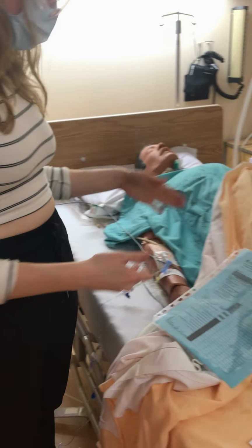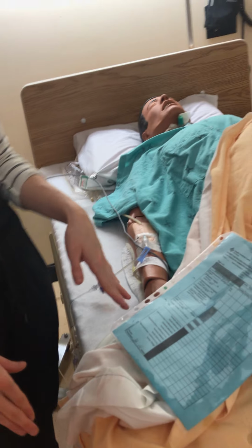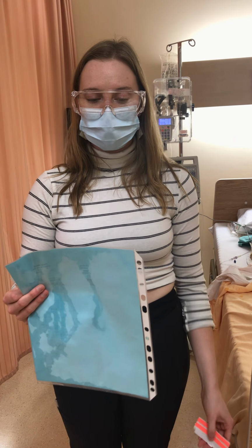I'll tell the patient to call me if they're experiencing any strange side effects or symptoms. I'd make sure to check up on their vital signs. I will sign the MAR with the date and the time as well. I'll get my second nurse to sign the MAR with me. And I would do a final safety check before I left the room. But other than that, I am all finished. So that was the demonstration of PCA morphine.